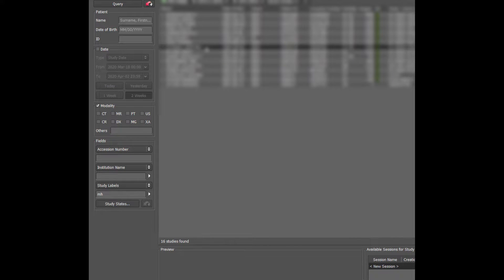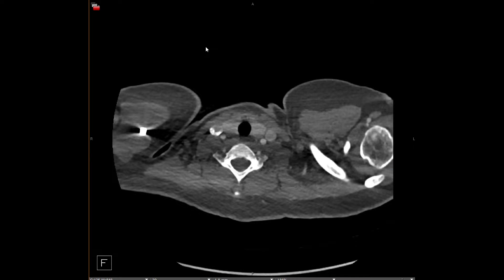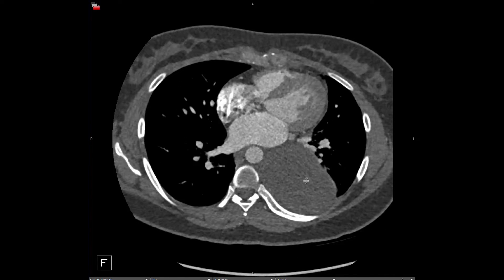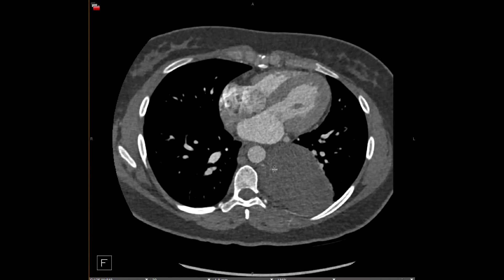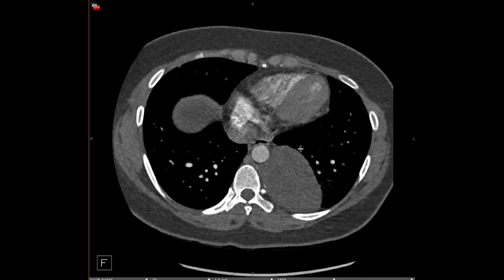Moving on to sequestration. Sequestration is defined as systemic arterial supply to a lung parenchyma. There are two kinds: intralobar and extralobar. Here we have a large mass-like lesion with systemic arterial supply — here's an aortic feeding vessel. Intralobar sequestrations exist within the normal pleural covering of the lung and have pulmonary venous drainage. Extralobar sequestrations have a separate pleural covering and will have systemic venous drainage, and can even occur in the upper abdomen.